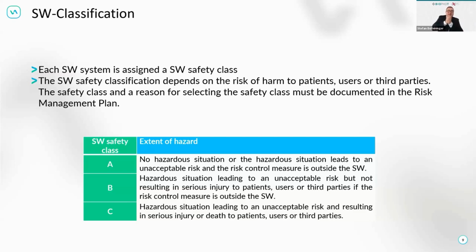So, I told you that the technical documentation for all medical devices is the same. That's true on the MDR level. So the MDR has Annex 2 and Annex 3, which always is the same. So now we get into the standards, for instance, 62304, and that one has particular other concerns and thinks about, hey, if you have a low-risk product and no risks, no harms, no hazards, then you should do less. If you have a higher-risk product, you need to do more to get more control.